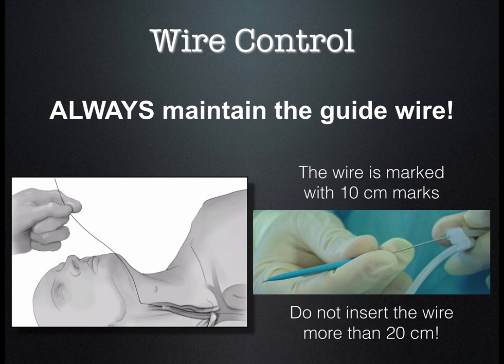So always maintain your guide wire by either holding it before the catheter or as it's exiting the catheter. But your hand, once the wire is in the patient, should always be touching the wire.